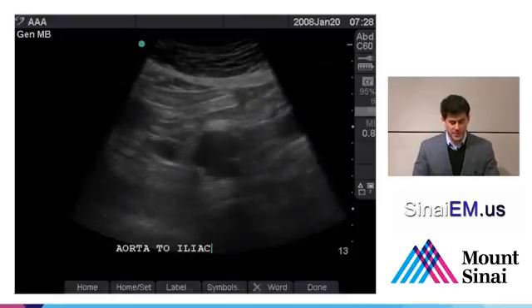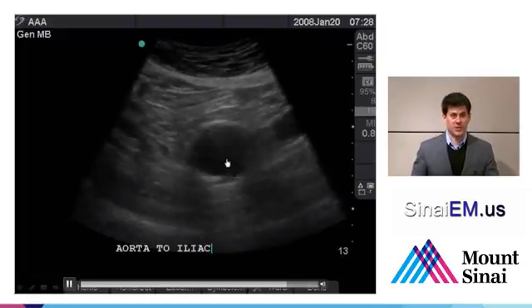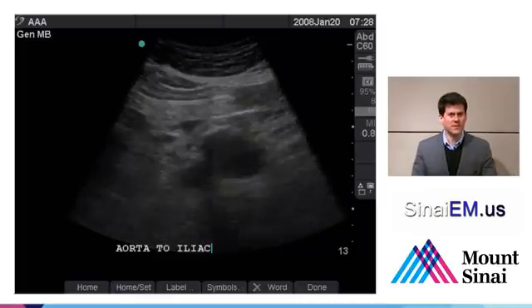So here's an example of the iliac bifurcation where the left iliac goes off in a normal caliber and the right iliac is aneurysmal here. And this was in a patient with a sensation of a cool right extremity. It was a little clammy compared to the other side. The patient had reasonable pulses and a very subjective change in sensation.